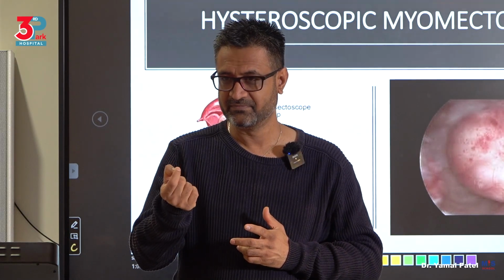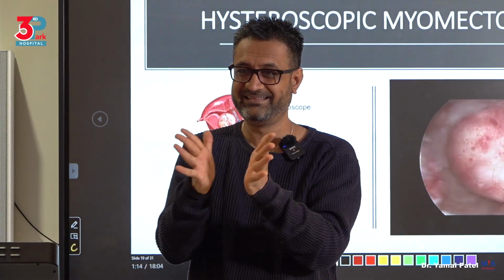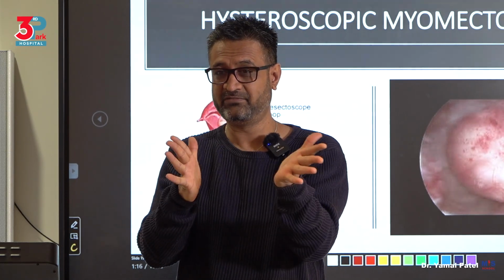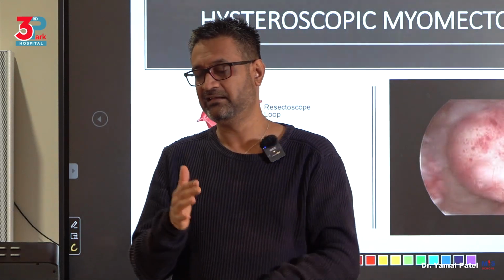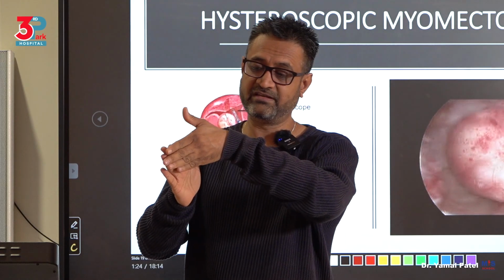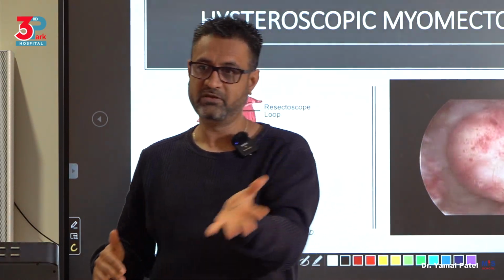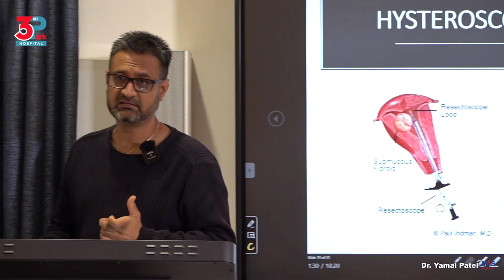It's thin and it's damaged because where it was stuck, there is no endometrium between that. That's why it got stuck. So this is myometrium stuck to myometrium. You separate it and you use energy, then again, you damage the base of that. So you don't even allow this endometrium to probably overgrow it. So trying cold scissors dissection in synechiae is better than energy. Got it?